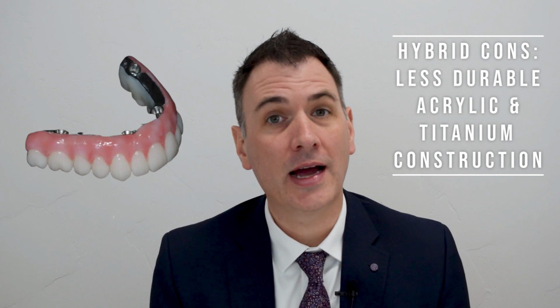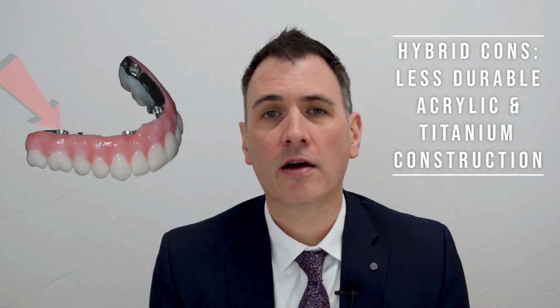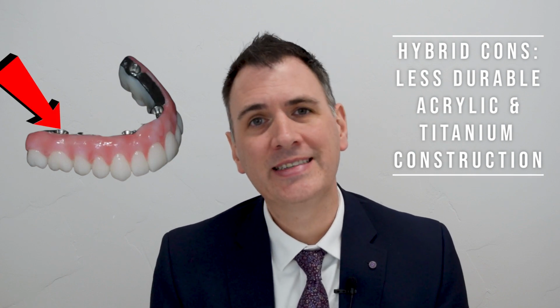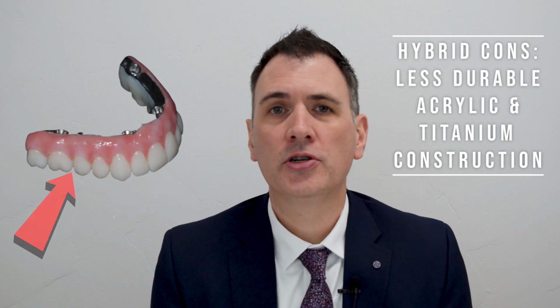So on the hybrid, on the internal of it, there's a titanium bar that adds a lot of strength to the material. And then it's covered with acrylic that's pink to mimic your gums. And then set into that acrylic is plastic teeth. Now the hybrid option is considered a shorter lasting appliance because of the plastic and the acrylic. It tends to wear down at a much quicker rate because it's pretty soft materials.